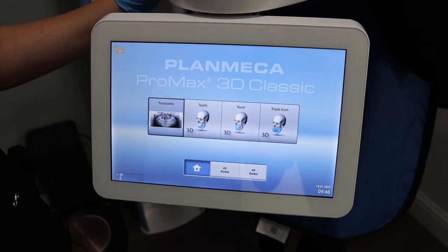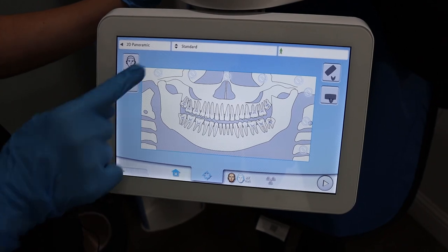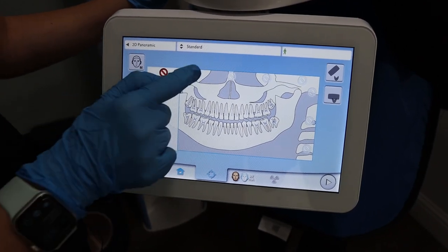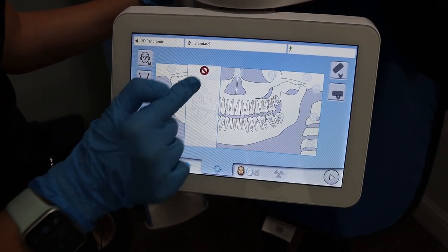You're going to click the panoramic button. Depending on the type of x-ray you're taking, you can block off certain sections of the pano machine. In this case, we'll be taking a full panoramic x-ray.